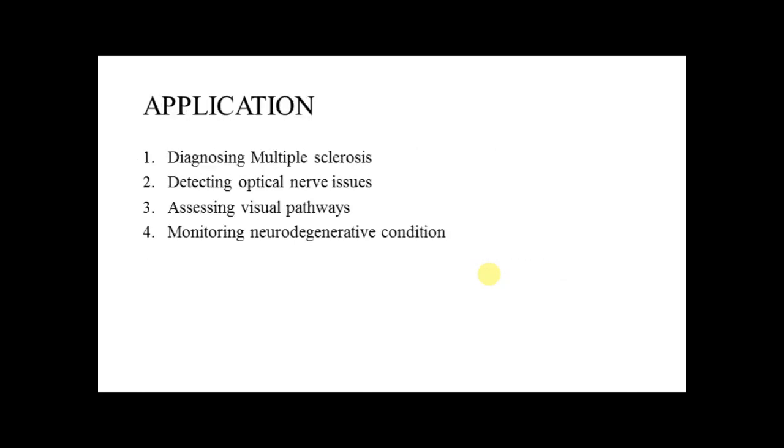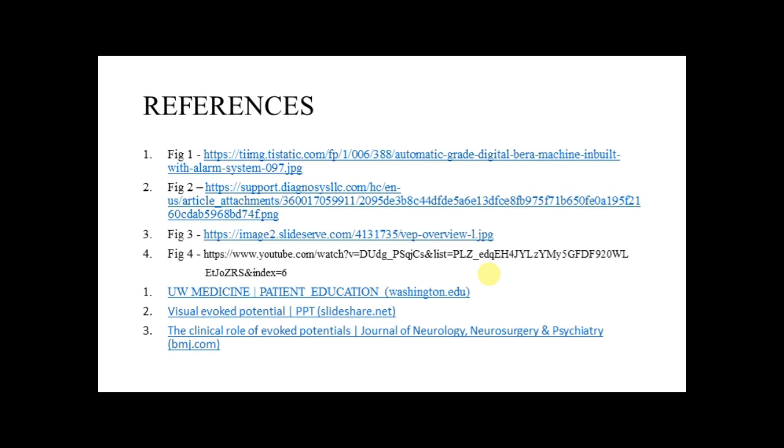Here are the applications: we can use it for diagnosing multiple sclerosis, detecting optic nerve issues, assessing visual pathways, and monitoring neurodegenerative conditions. Okay, so these are my references, and thank you guys.